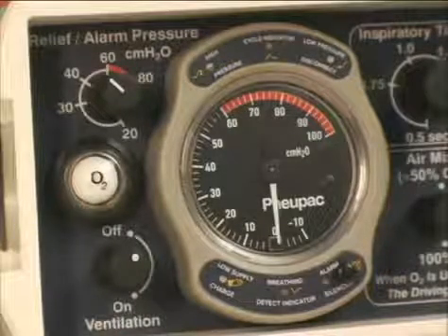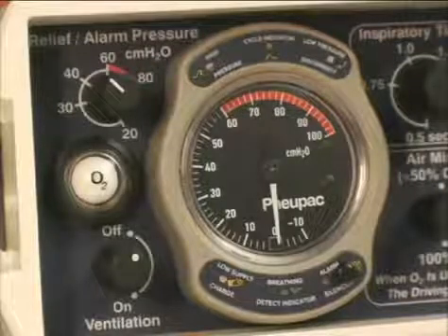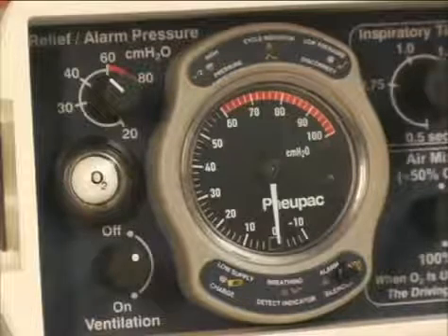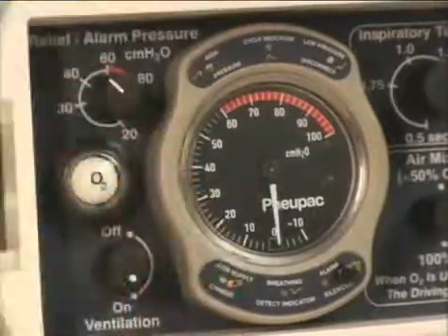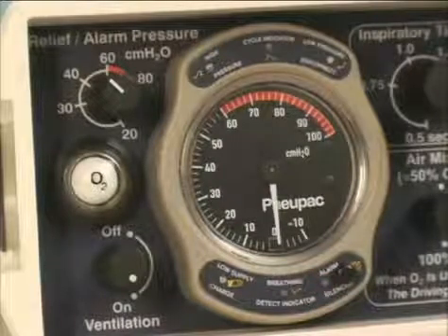Turn the main pneumatic switch to on. The ventilator should begin to cycle. Check that the alarm indicators flash in sequence, which indicates correct functioning. You will hear a single burst of the high-priority audible alarm. The orange silencing indicator should flash for 60 seconds.